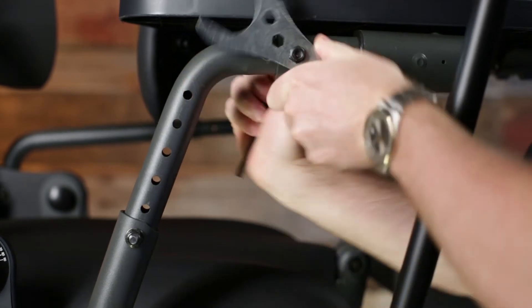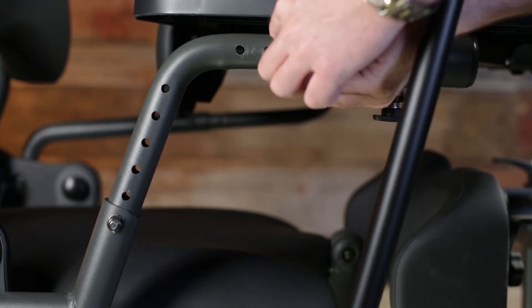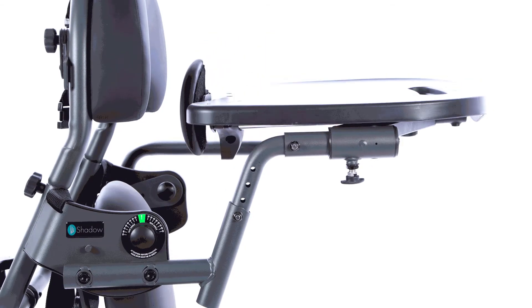The new shadow tray can be adjusted in backed tray depth from 4 to 20 inches and in seat-to-tray height from 7 to 12 inches, which covers the usable height and depth ranges for all six of the previous shadow tray options.